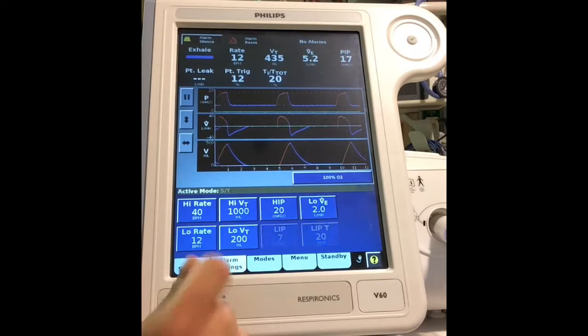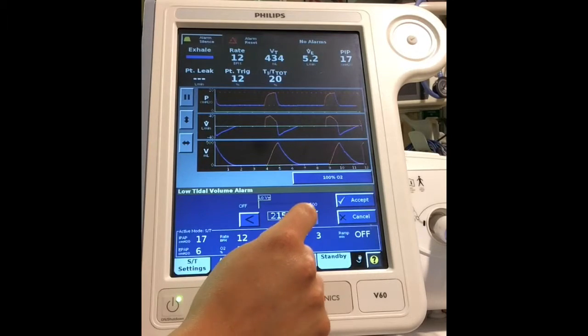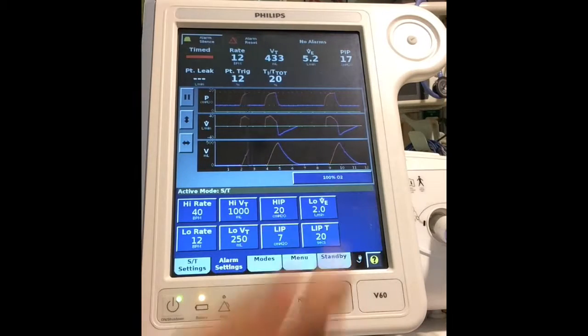Alarm settings. So let's go into our alarms, and we keep the high rate at 40. Our low rate is 1 above our set rate. So we're set at 12 currently. We would want to change this to 13, so then the machine will go off. I have it at 12, so my machine doesn't alarm while we're doing our testing, or while I'm doing the video. So this would normally go up to 13. Our high tidal volume is 1,000. Our low tidal volume is 200 below what we want to achieve. So if we're 450 to 500, we want 200 less than that. So let's just go up to 250.